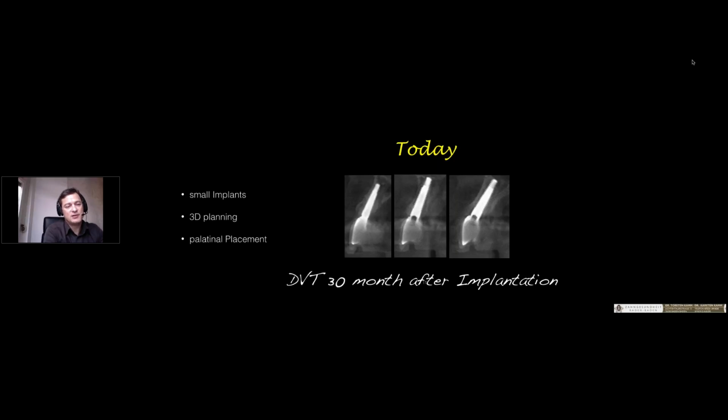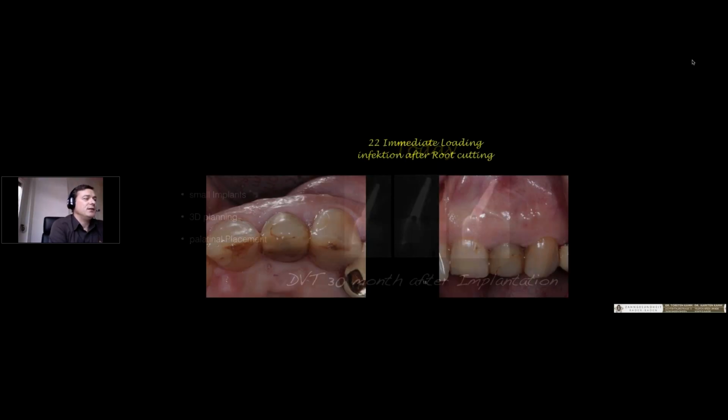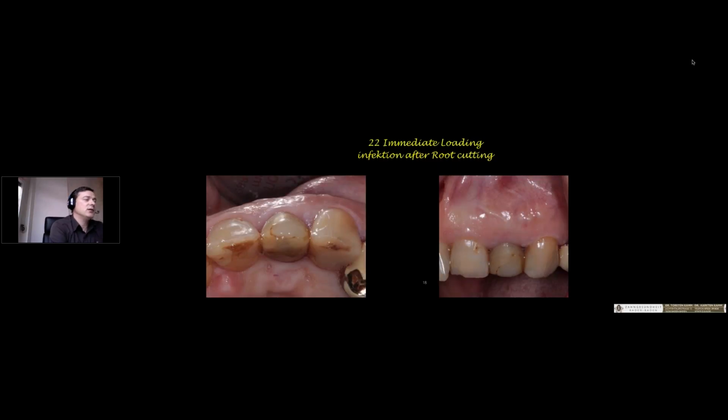It's not important on the apical side; you can go outside the bone. This is because if you're changing the axis, it's no problem to go a little bit outside the bone. It's the same as with normal teeth. You have many fenestrations of the teeth on the buccal side, but it has no effect on the aesthetic results. But you need a big buccal bone on the top. It's very important. So, next slide. Here is one of the cases. You see the case you've seen before in the X-ray.